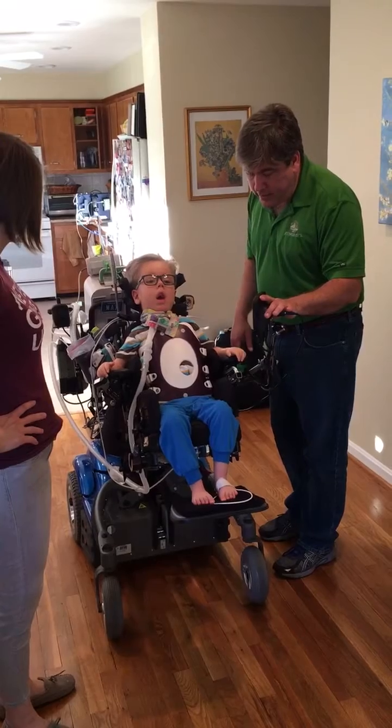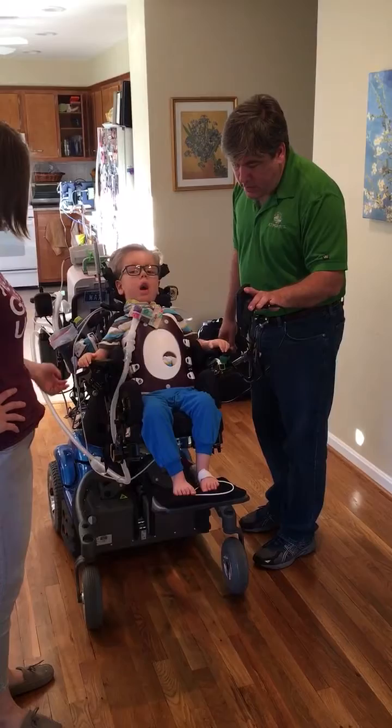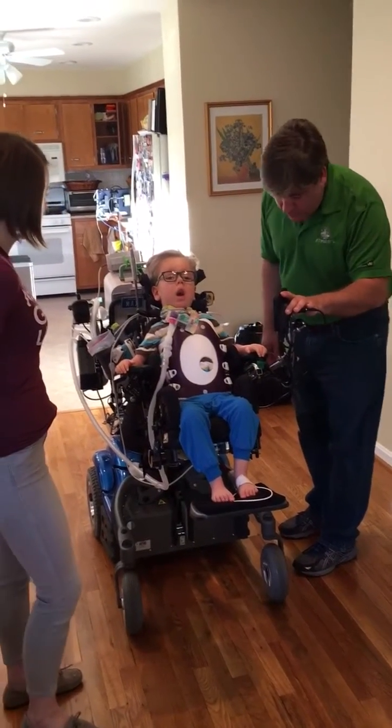Your finger's not on that one. Can you put his fingers on that switch? Up, up, and on. Very good. I don't even have to help. All right, very good.